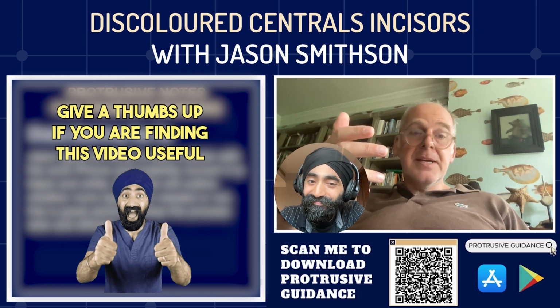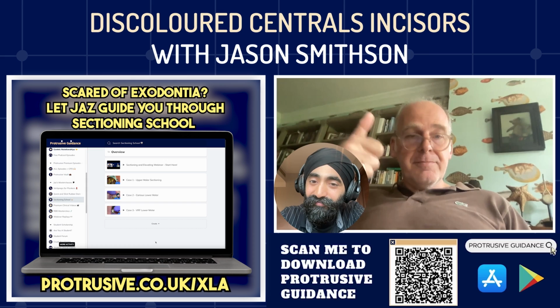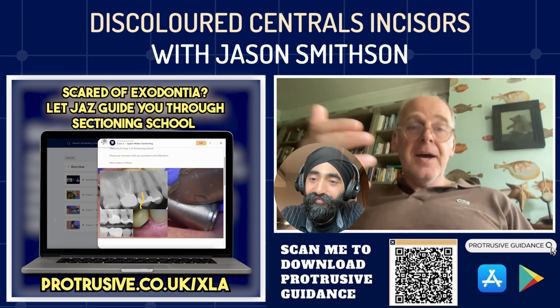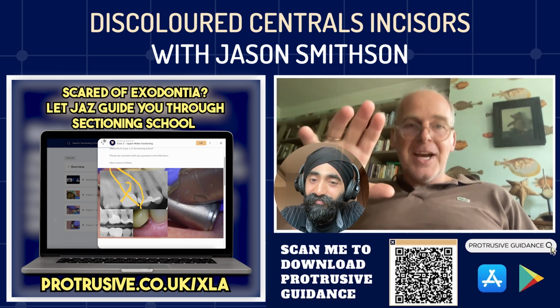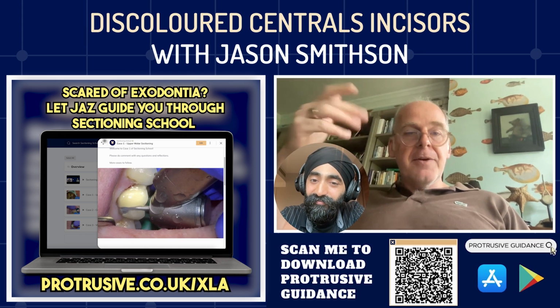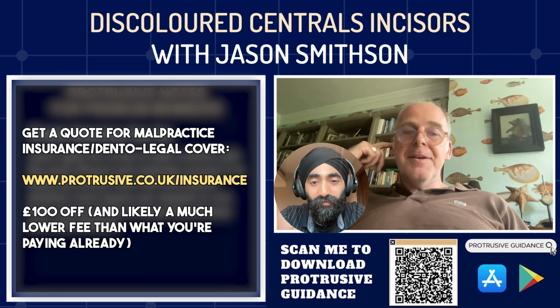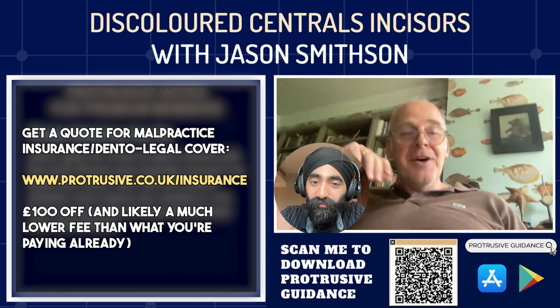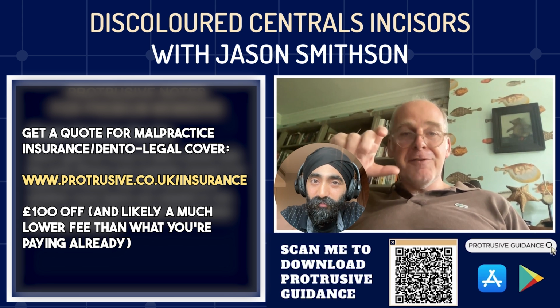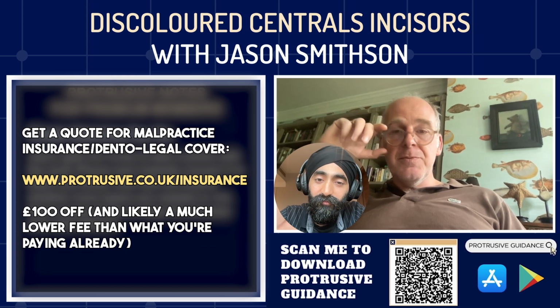And she'll look at it and say yes or no. And if it's a no, I put another layer on, bang, no, another layer, bang, yes, that's about right. When she says yes, I'll have a look at it and just check it. So obviously there's a level of trust. And then we move on to layering the chromatic enamel and the effect shade. And let's be clear here, from a GDPR point of view, obviously we use a separate iPhone that's dedicated to this. But yeah, that's a really good, efficient way of doing it.